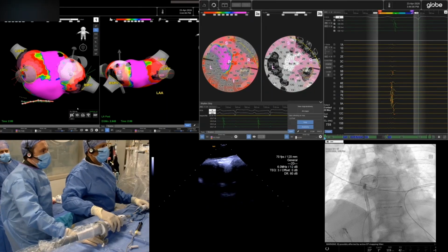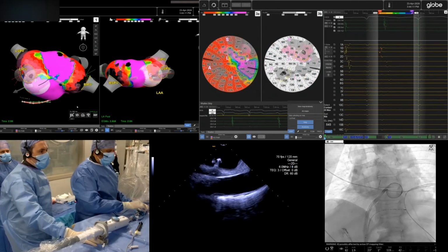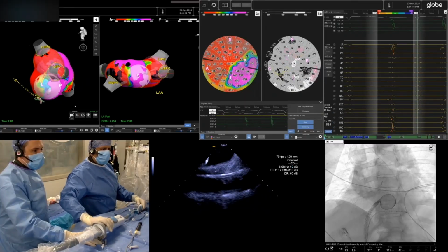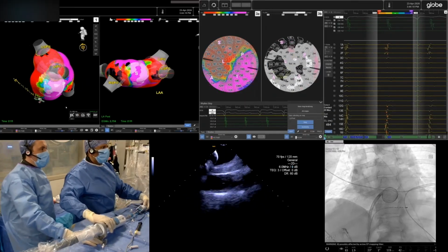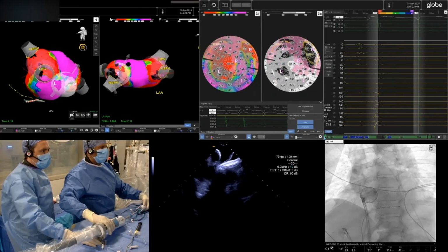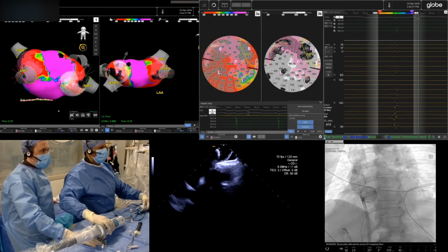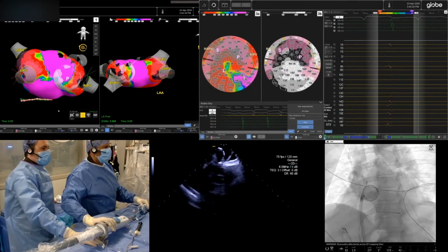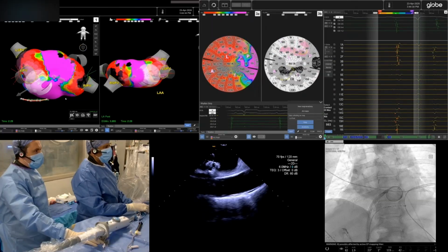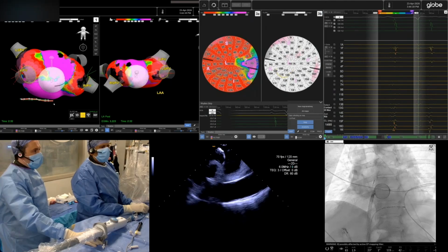Yeah, look, all I can tell you is what we know empirically. Empirically, we've been able to treat all these patients in a multi-center pivotal trial. All the patients were treated successfully, 100% isolation of the veins. Now, in terms of having too many choices, it's still an issue, I agree. We're still learning a lot about these technologies. Everyone has their strengths and weaknesses. On this one, hemolysis is a trivial issue. Contact is assured. So there are some good things about it. And I think with time, we'll probably understand which is most important.